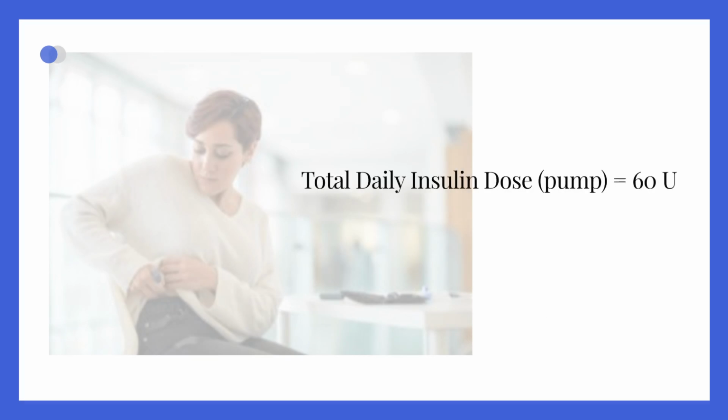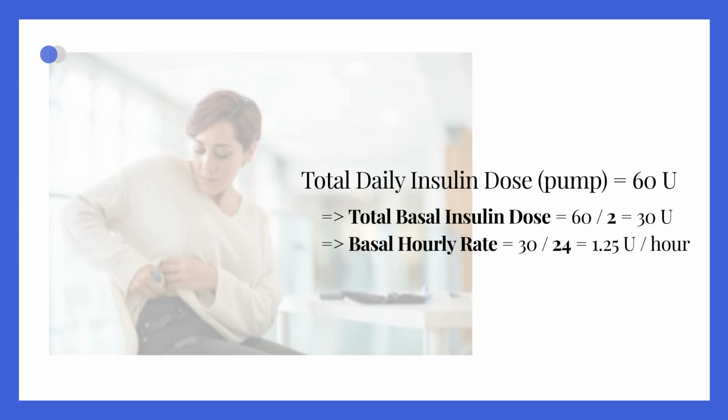In our previous example, we determined that Anne's total daily insulin requirement would be 60 units when switching to an insulin pump. From this, her total basal insulin need can be calculated to be 30 units per day. By dividing this amount by 24 hours, we arrive at a calculated basal insulin rate of 1.25 units per hour.